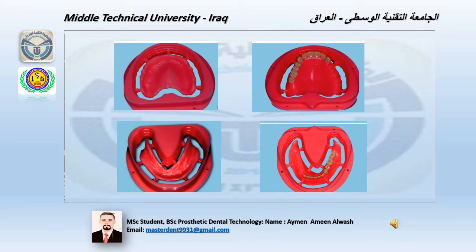After we do the arrangement of the teeth by using the specialized software of this system, now we are ready for milling, but we use a blank of wax pattern for fabrication of the base plate of the complete denture, and then we set the artificial teeth inside the socket of the wax denture base.